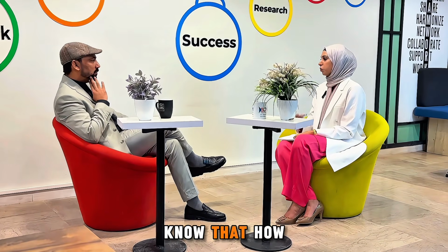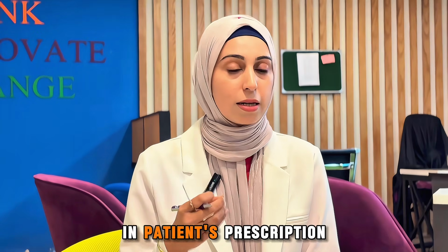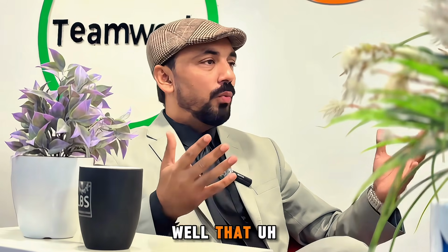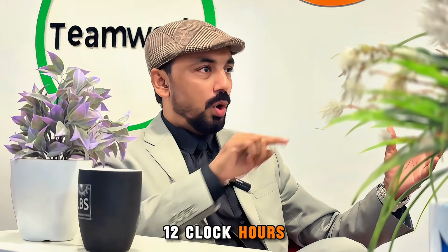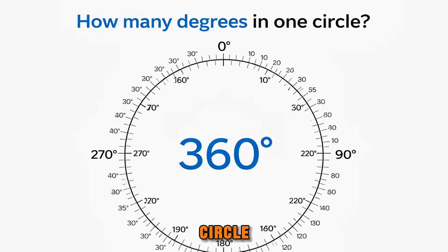Sir, how do we know how many axes we have to deduct or add in the patient's prescription? So the calculations are very simple. You know very well that in a whole circle there are 12 clock hours: 1, 2, 3, 4, 5, 6, 7, 8, 9, 10, 11 and 12. And you know very well we have 360 degrees in a whole circle. So 12 clock hours in a circle and 360 degrees in a circle.